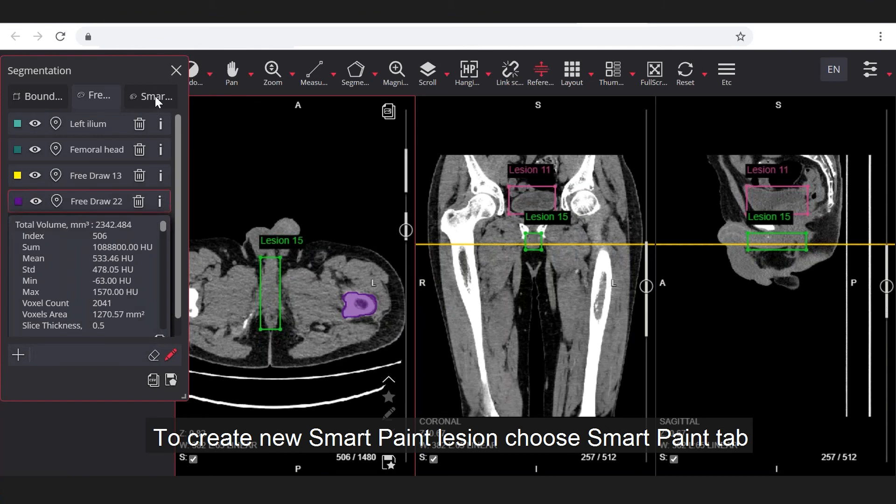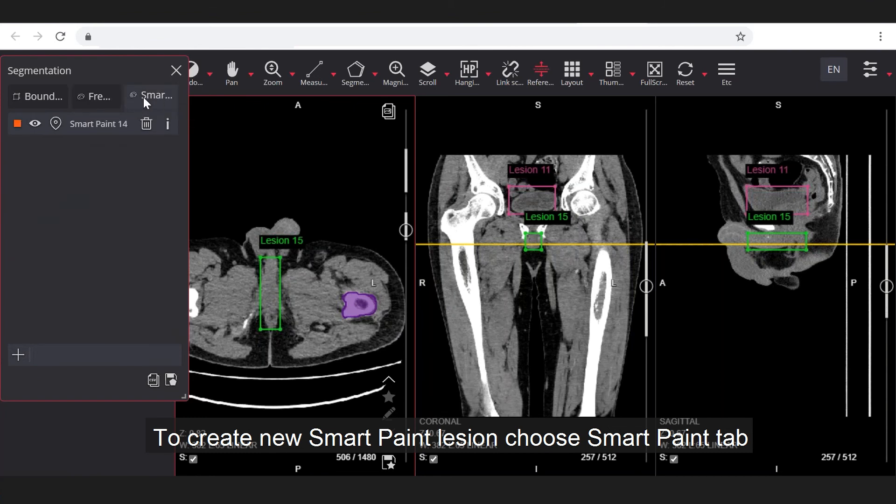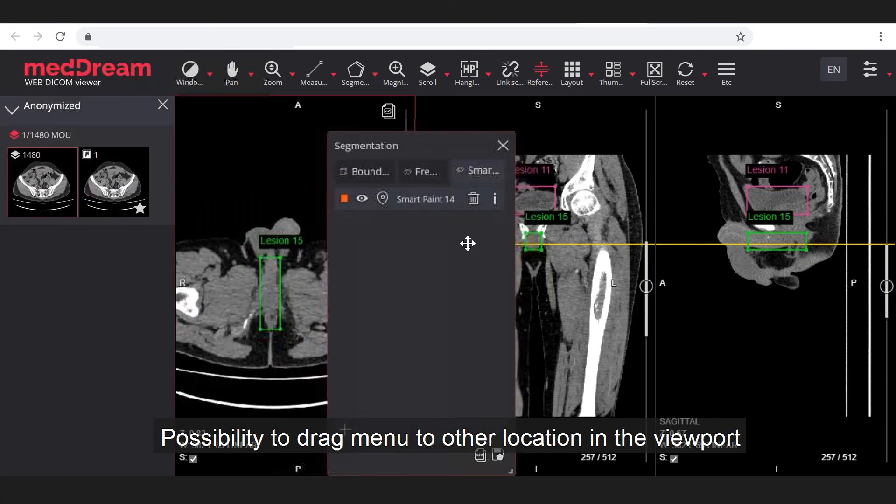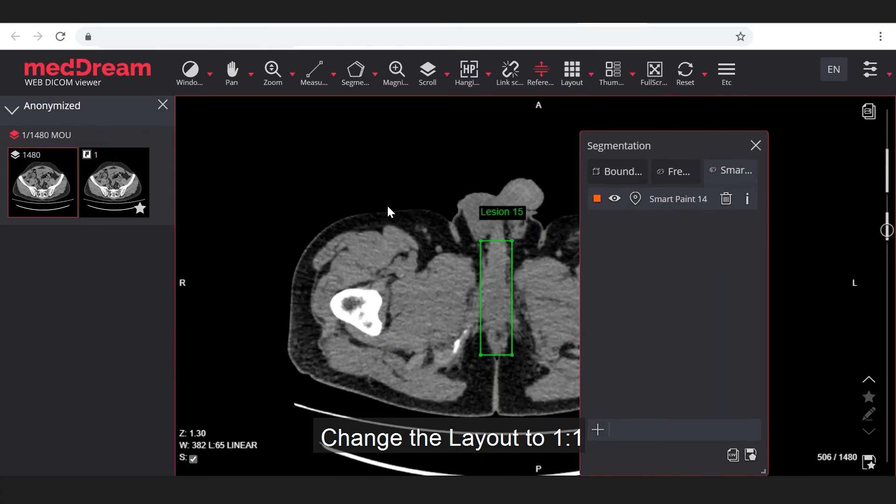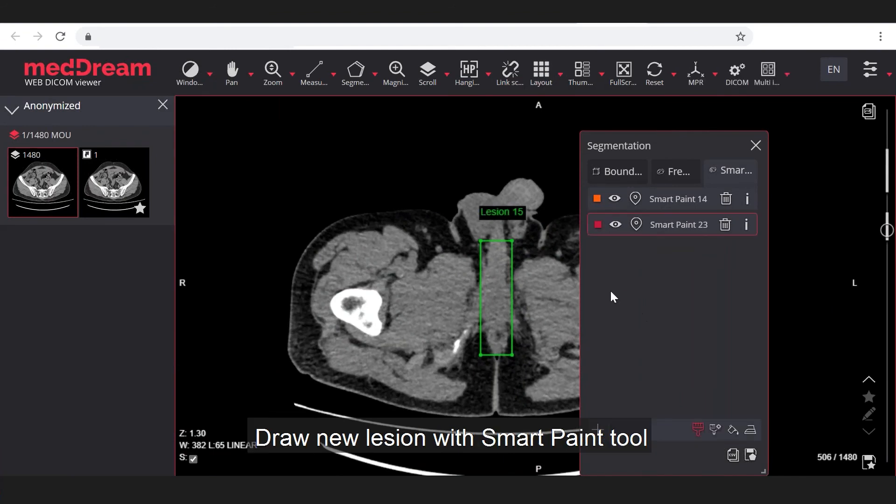Choose smart paint tab. You can drag menu to other location. Change the layout to one-on-one. Click on add new button. Draw new lesion with smart paint tool.